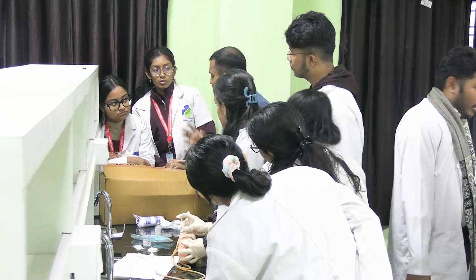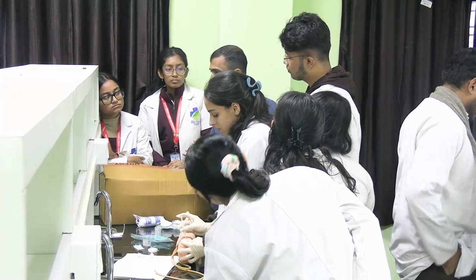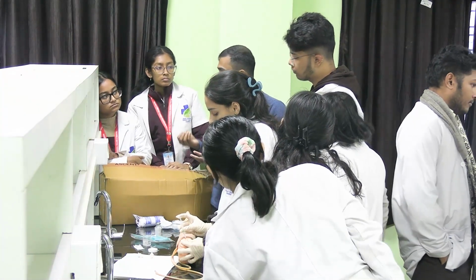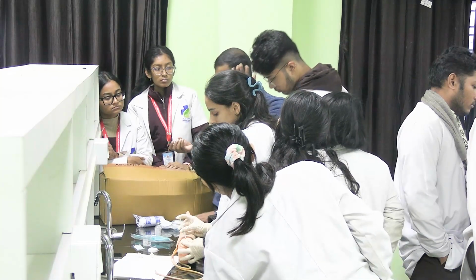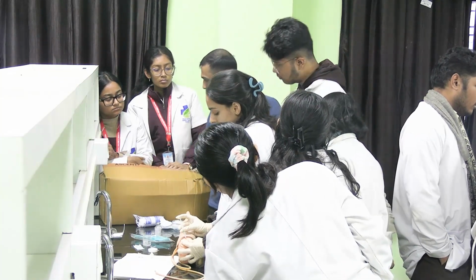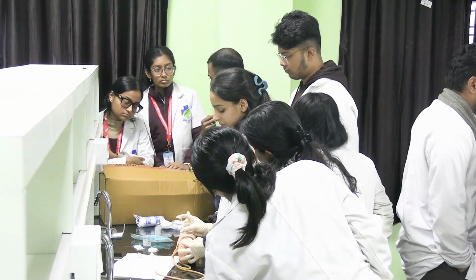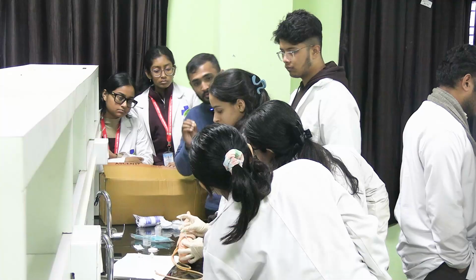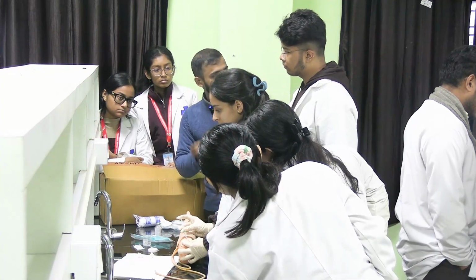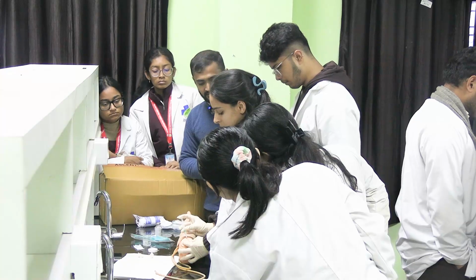Blood is... sometimes, not sometimes. Anatomically, the blood supply is less in the subcutaneous tissue. We all know this is a fatty layer, so there are fewer chances of getting into a blood vessel. But still, as a precaution, we withdraw the needle and aspirate it for checking, to avoid complications. If your examiner asks, you tell in this way. So check it, aspirate it.